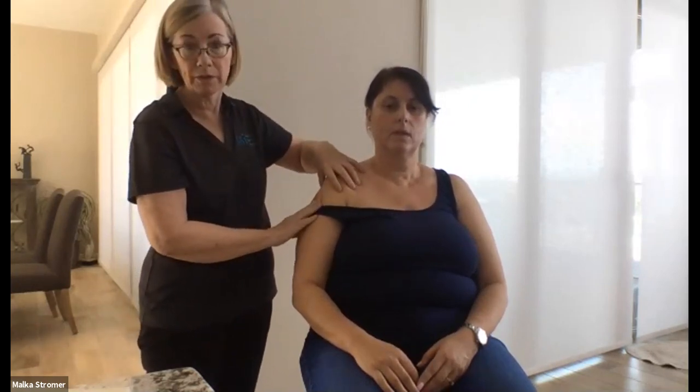So we're going to start on her shoulder. One thing you want to start with is to make sure this shoulder is free. People will try to pull a shirt up, but it doesn't give you enough room to see what you need to. You can gown the patient, make a little toga here. She's okay with pulling the shirt down to keep this shoulder open. I'm going to run through how we would do a scan, and then we'll flip over to the ultrasound image so you can see what it is.